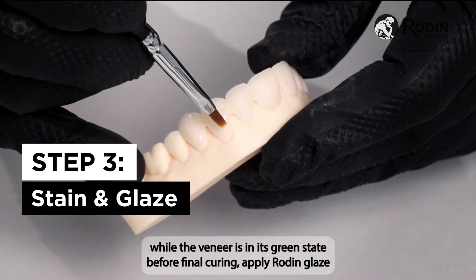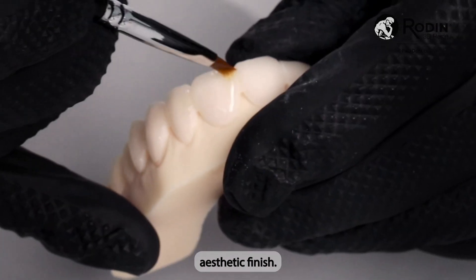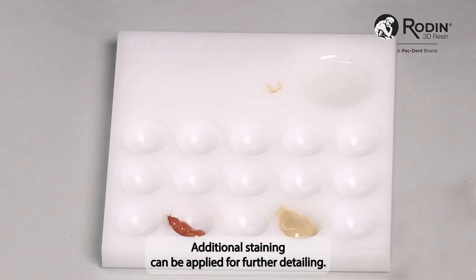Before final curing, apply Rodin Glaze N2-Free to add a protective layer and achieve a polished aesthetic finish. Additional staining can be applied for further detailing.